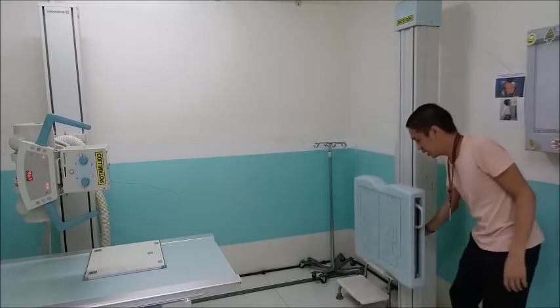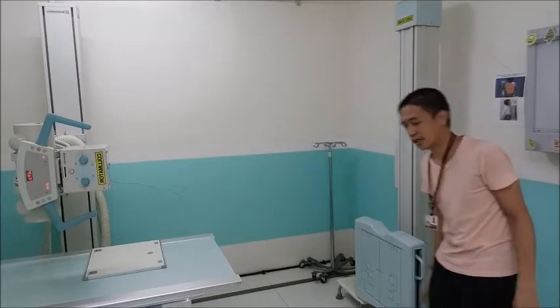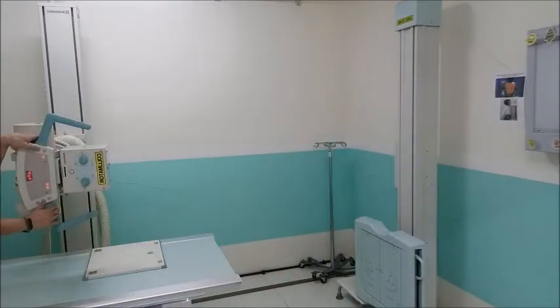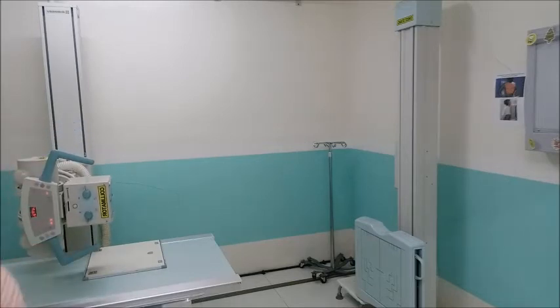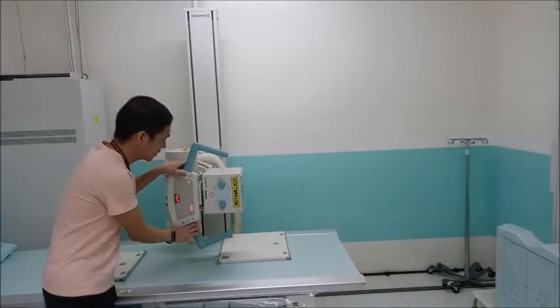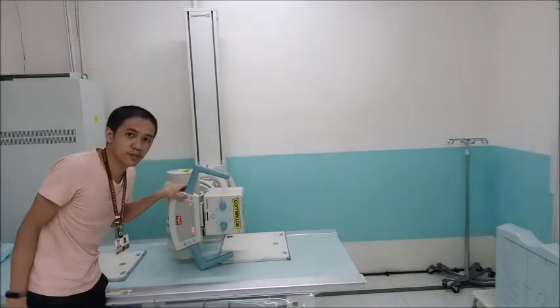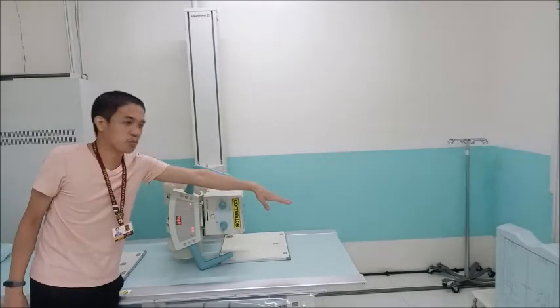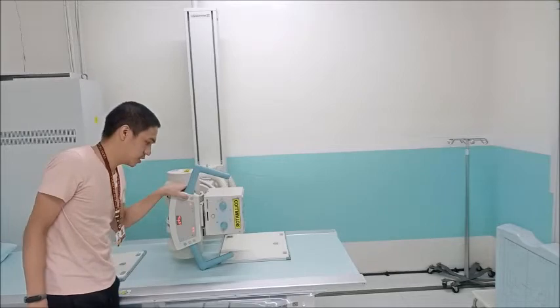Okay, but then there are limitations for the downward movement. The chest bucky can be lowered down, but then the limitation is with your tube. The X-ray tube is here. You cannot angulate it downward, because the patient is short. So you cannot angulate the X-ray tube.